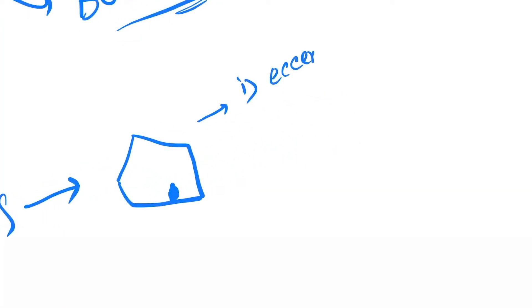The nucleus, first one, is eccentric - not in the center. Number two will be completely vacuolated. And number three is polygonal in nature. So these three features of the fat cell will help you identify the lipoma along with the capsular layer and fibrous septa.